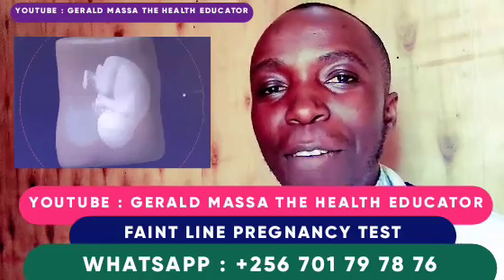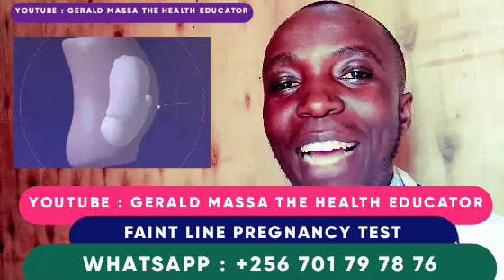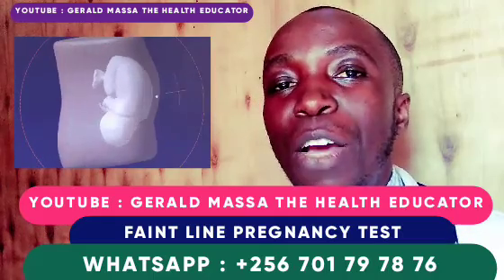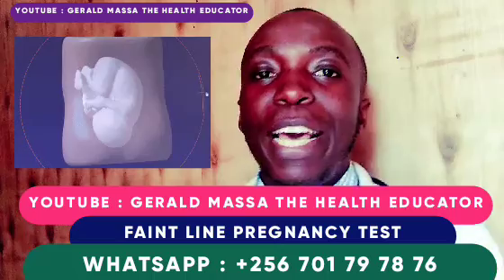Maybe you could have tested very early. Maybe you used a container which had lots of water and the urine was diluted, and thereby the levels of the HCG were low. Or maybe you even did the tests very early when the levels of the HCG hormone were still low.